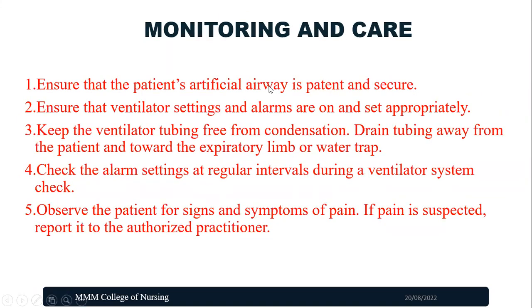So after doing all this, for everything, nurses alone cannot be doing it. You have to call either the biomedical engineer or the respiratory therapist or the intensivist to attend all these alarms. As a nurse, we can perform any actions within our scope of practice. Once it goes beyond the scope of practice, please contact the necessary healthcare professionals or the paramedical people to attend the ventilator.